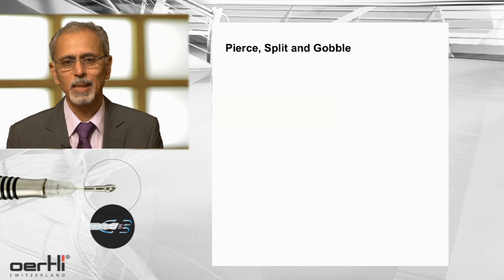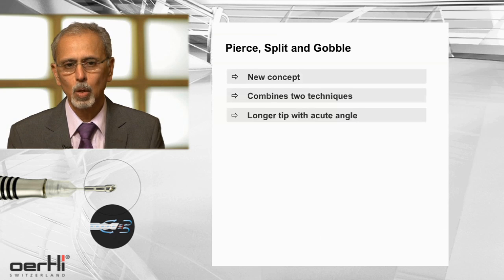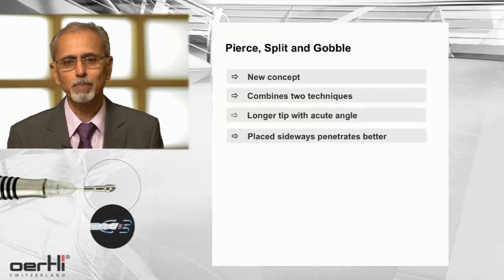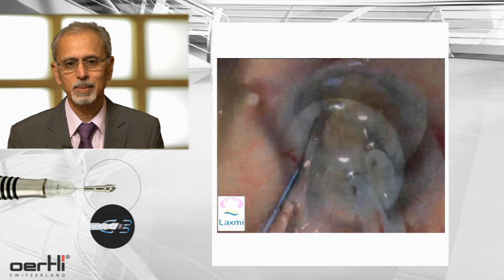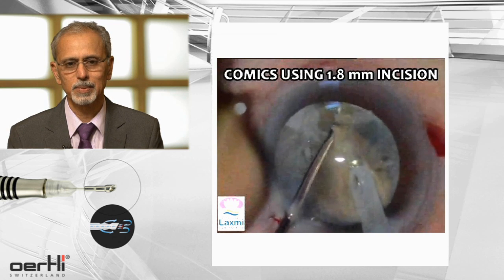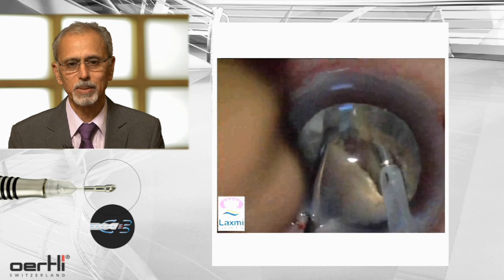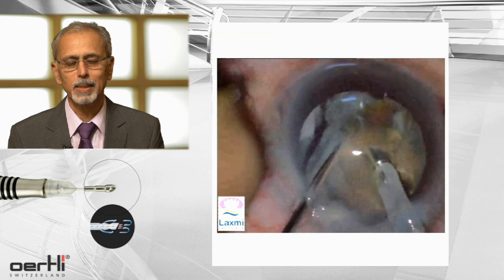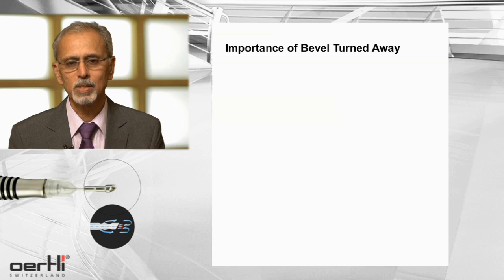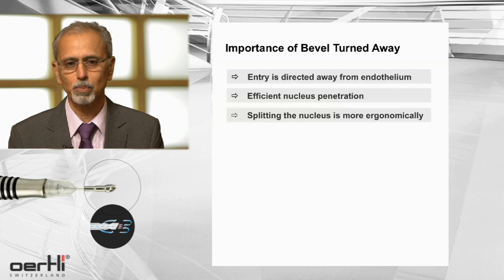This is a second skill I have coined as 'pierce, split and gobble' — it's a new concept. A longer tip with an acute angle, when placed sideways, penetrates. As you can see here, a sharp tip and a hard cataract — it can split a hard nucleus into two fragments. What it needs is you penetrate, get a good grab on the nucleus, and use a blunt tip chopper. The importance of attacking the lens with the bevel turned sideways is that the entry is directed away from the endothelium and it penetrates into the hard nucleus more efficiently.